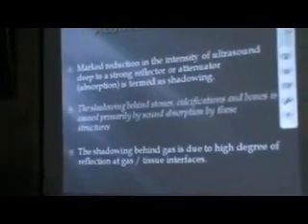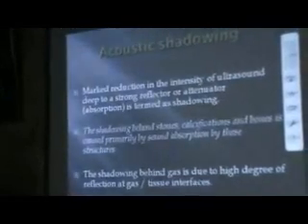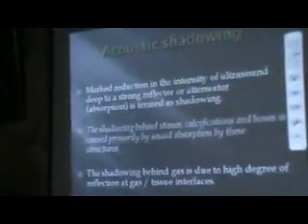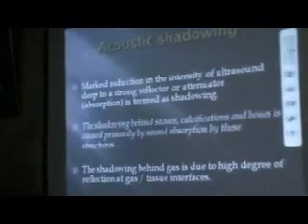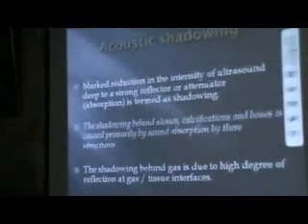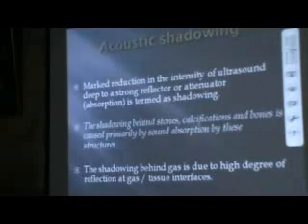Acoustic shadows mark a reduction in the intensity of the ultrasound due to a strong reflector or attenuator. The shadowing behind stones, calcification and bone is caused primarily by absorption by the structure. The shadowing behind gas is due to a high degree of reflection at gas-tissue interfaces.